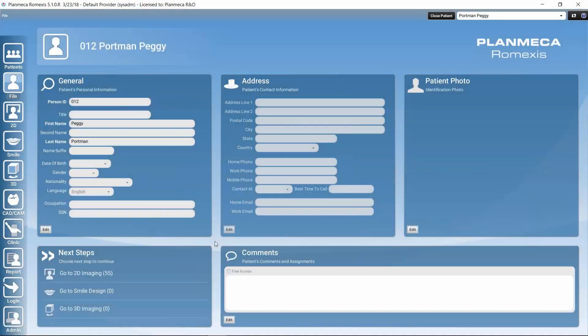In this tutorial, we're going to take a look at study templates in PlanMeca Romexis 2D module. Studies are image collections that are related to each other, usually the same patient's images — for example, an intraoral image collection. Instead of layouts that are meant only for temporary image viewing, these studies can be permanently saved in Romexis, so we can always open the images in the collection we built and view them together.